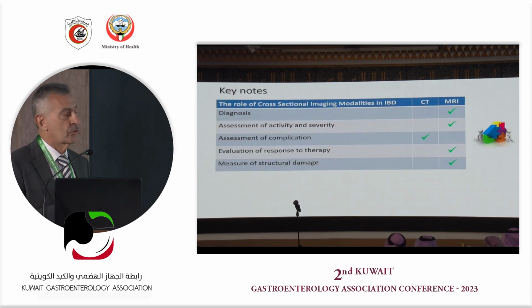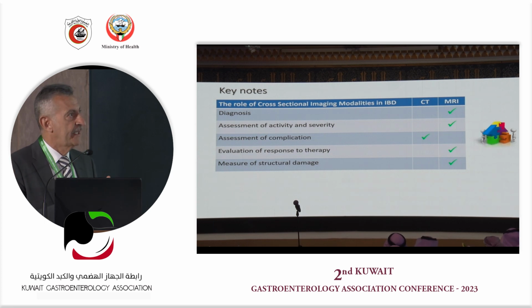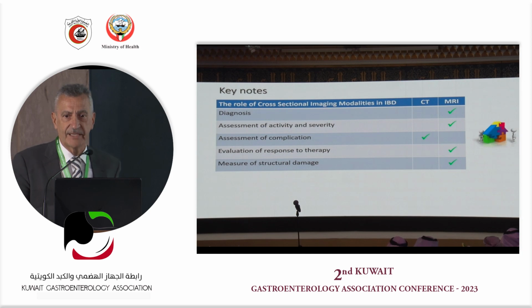So I keep it very short because we have little time, and these are my keynotes. Basically, for diagnosis, for the assessment of activity, for the evaluation of response to therapy, for the structural damage, and for the pelvis, MRI is the way to go. CT just remains in use for complications. Thank you for your attention.